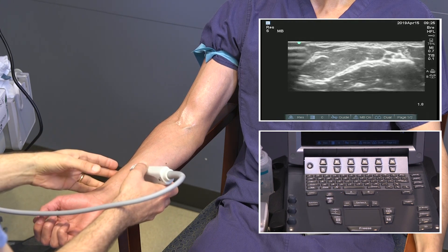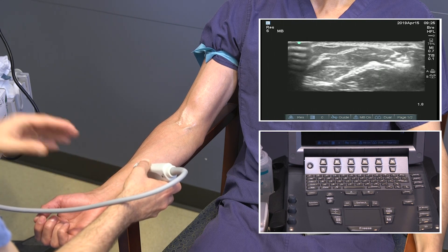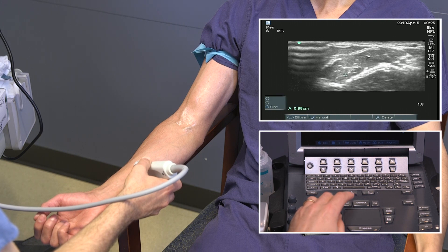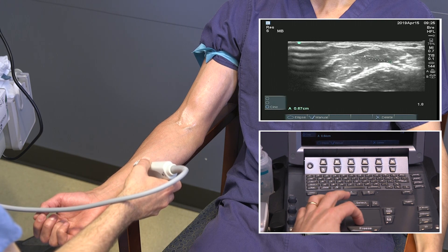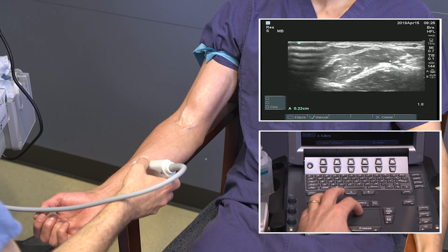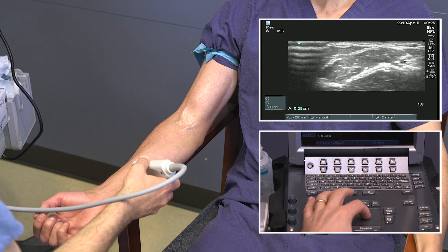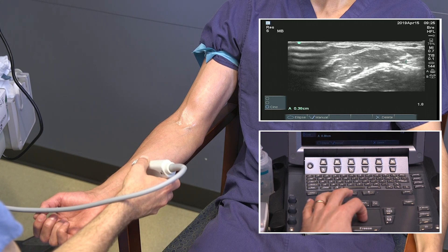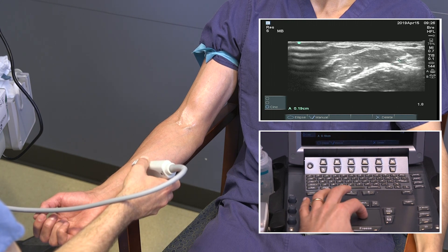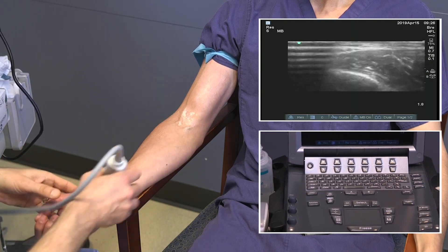It's possible to access the vessels about a third of the way up the forearm from the wrist. Any further than that really gets too close to the fistula creation site. As we look at this one ulnar vein, we see that the measurement is about 1.7 millimeters, which is a little bit small — a 2-millimeter vessel would be preferred. The ulnar artery itself measured 1.9 millimeters.